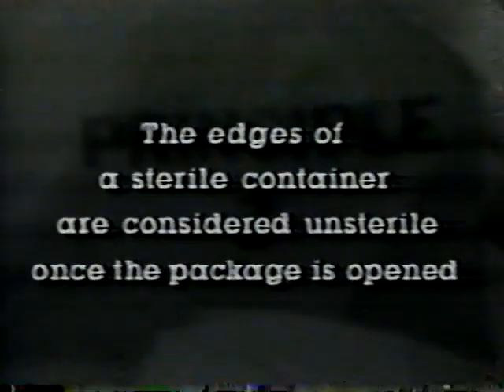Principle number 3. The edges of a sterile container are considered unsterile once the package is opened. These boundaries are hypothetical and are safety margins. The boundaries should be maintained in an aseptic environment to prevent accidental contamination of a sterile field.